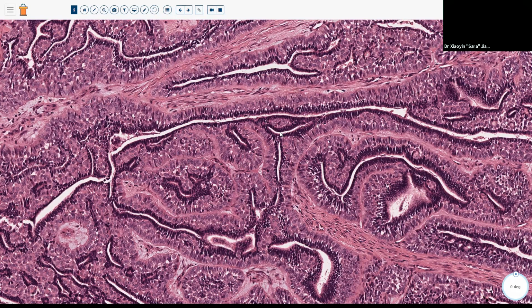So you've got your myoepithelial markers, so P63, calponin, S100, which kind of preferentially stains your myoeps. And then your epithelial component is going to stain with cytokeratins, your CK7, AE1/AE3, CAM5.2. It's going to really more strongly highlight your epithelial component.